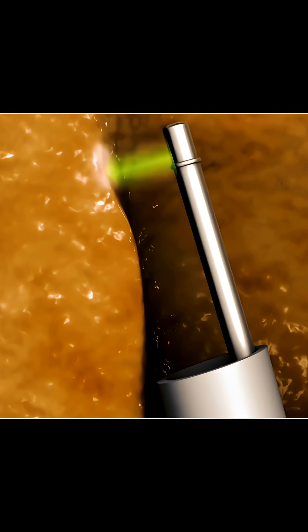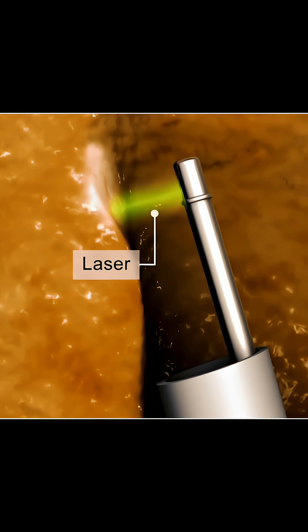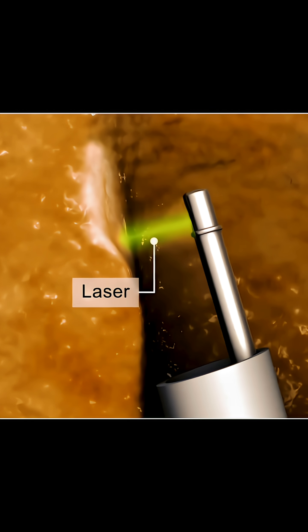Minimally invasive variations of TURP use lasers, microwaves, or radio waves to remove prostate tissue through the scope.